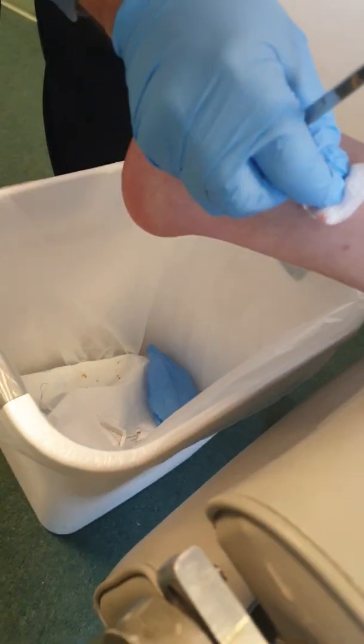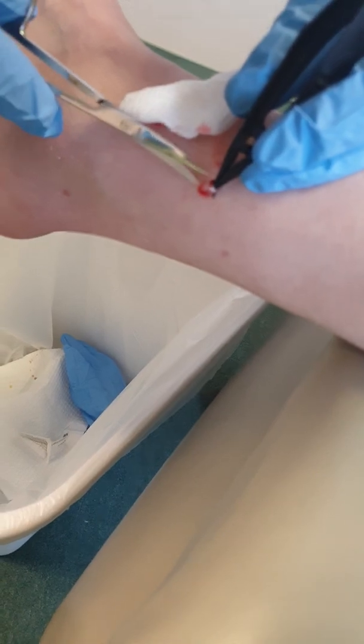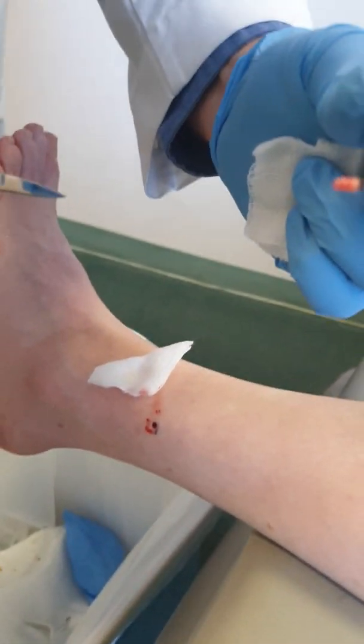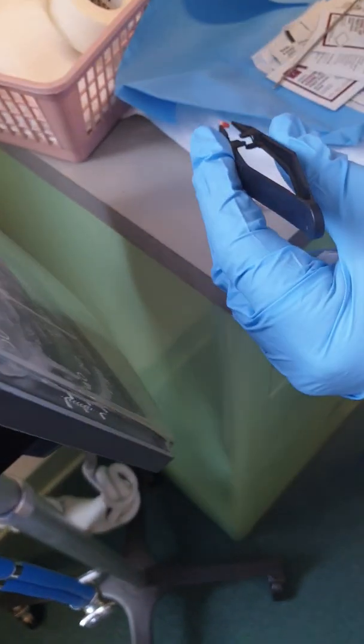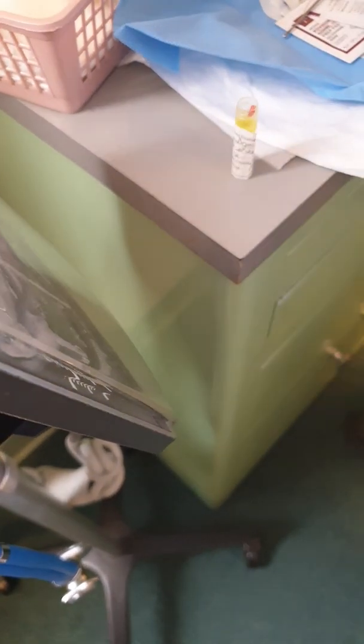I bring my scissor — remember, this is all sterile. We take the scissor and take the plug out right off where it's at. I don't squeeze it too much because I want to catch that nerve. As you can see, this is the plug that we remove, so we put this right into our specimen bottle and cap it off. We are done on that one.